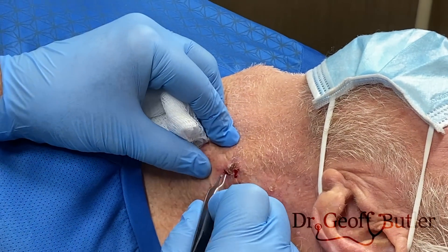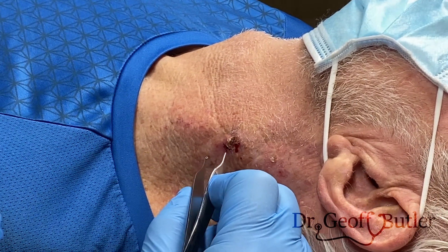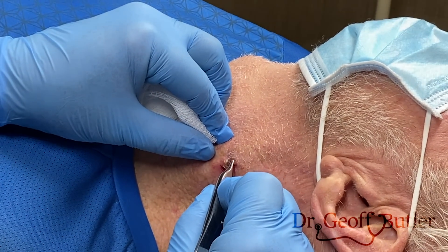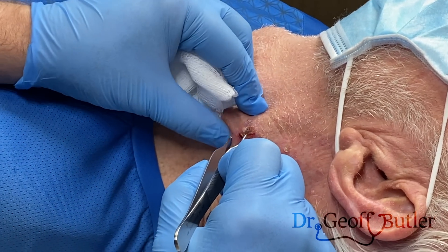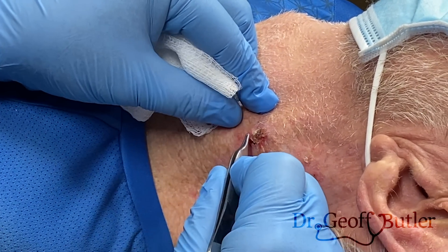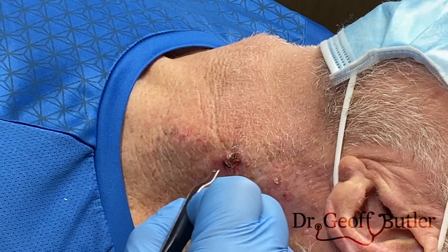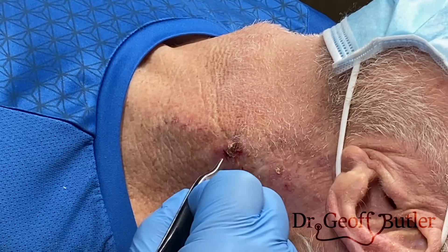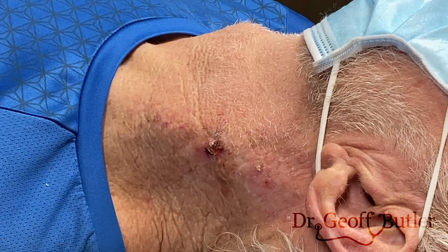I just wanted to show you this before I freeze it. Now from a biopsy perspective, this is where you have to make decisions. Normally if I do a punch biopsy, I want to punch biopsy around normal and abnormal tissue. But here, because of where it's at and the vessels underneath, I'm going to freeze it and do more of a shave biopsy, send that off, and then see if we can cauterize it. This anaplastic tissue doesn't cauterize quite as well, and you might see that when we try.